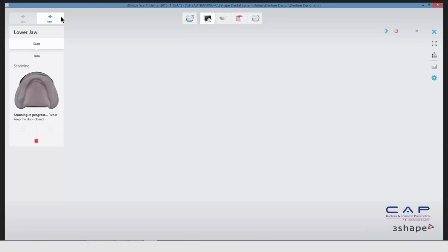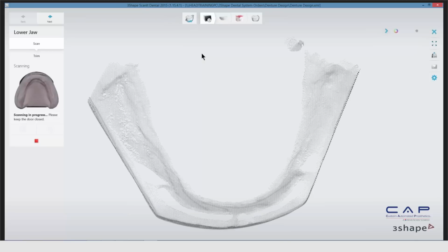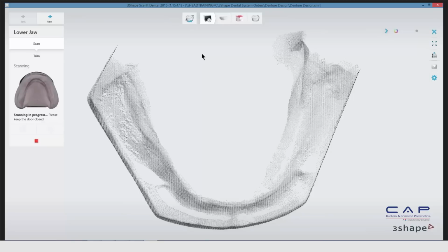Even with the D2000 and D1000, the larger scanners, it still tends to refract, so having some sort of spray, like they have on that little icon up here, helps to maintain the accuracy of that bite block. And these scans do take a little bit longer than a normal scan because it's capturing the whole arch, and there was no selection process done, so we can't accurately scan certain areas. It's just going to scan whatever it can as accurately as it can. So it's going to take a little while for these scans here.